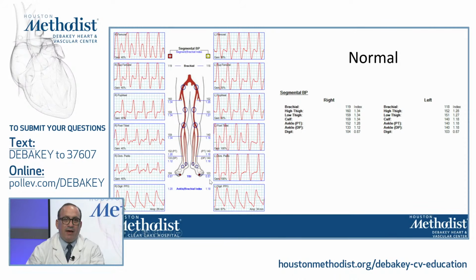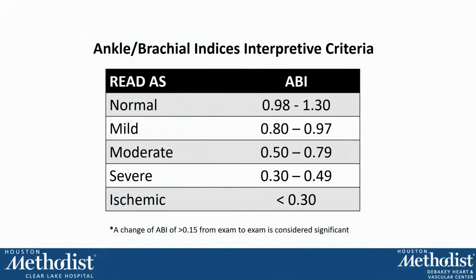And how do we get the ankle brachial index? For those who are new to ultrasound or physiologic tests, you get the highest brachial pressure, and you also take the ankle pressure, and you divide the ankle pressure by the brachial pressure, and that will give you the ankle brachial index for each segment, for the posterior tibial, anterior tibial vessels, or in this case the dorsalis pedis, which we will detect at the dorsum of the foot for both lower legs.